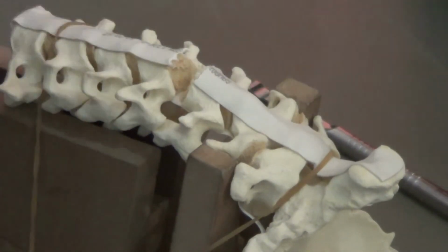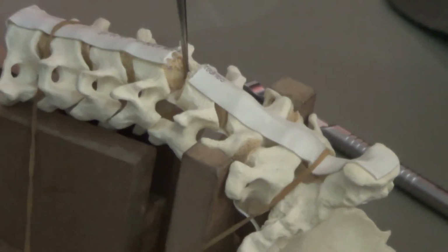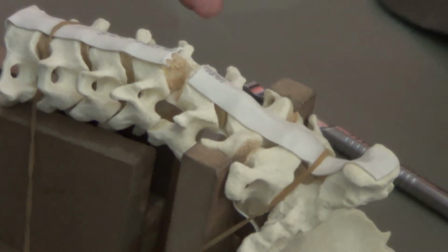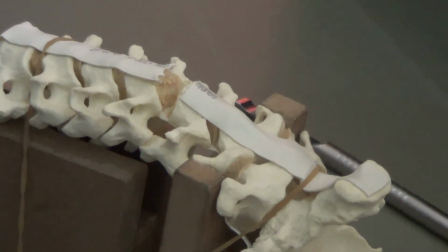One more point about removing the posterior longitudinal ligament. It depends on what sort of surgery. Say if it is a posterior disc, left or right, then definitely you will have to cut. But sometimes when it is well visualized, either with the microscope, loupe, or your own direct eye, you remove the disc very finely, and if there is already no pressure, you can feel it by your hand.